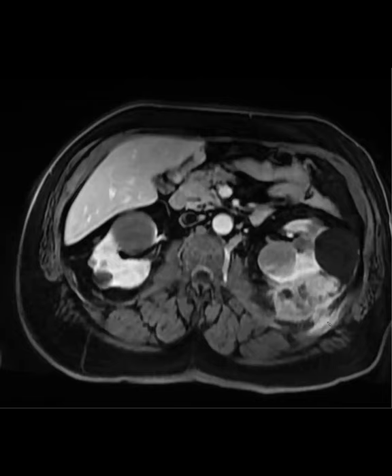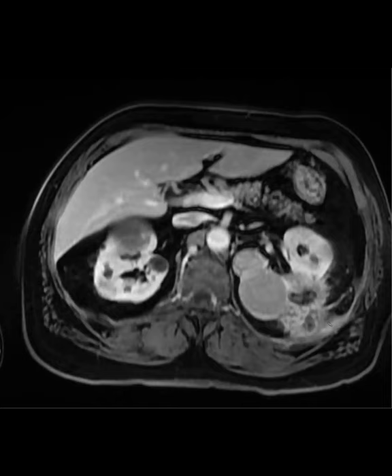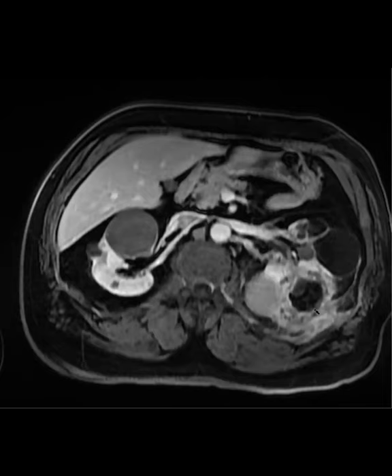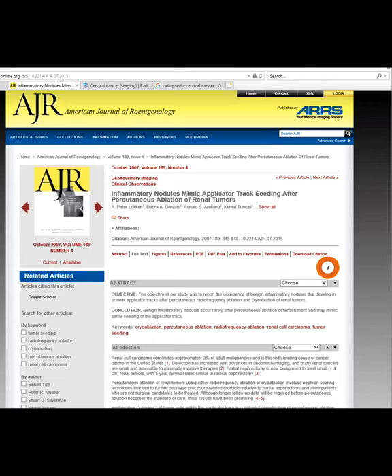Any other thoughts? I mean, if it's not neoplastic, then maybe it's some sort of inflammatory pseudomass or something. Yeah, so we thought this was really weird looking, and it came back really fast. So they ended up biopsying it and it came back basically, like you're saying, an inflammatory pseudotumor. And we found this paper, courtesy of my colleague, Melina. This was out of, I believe, the MGH or Brigham group. Oh, maybe both.